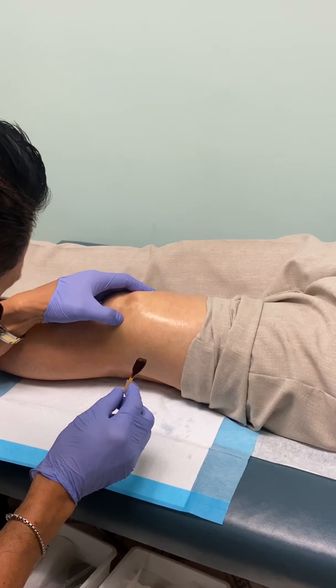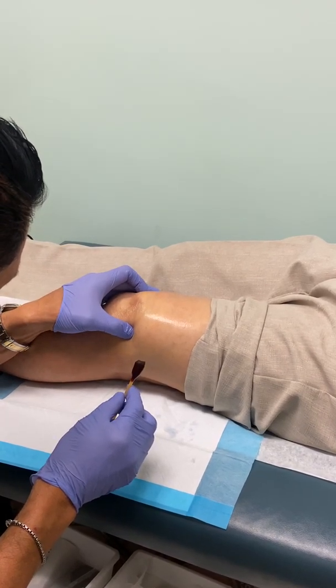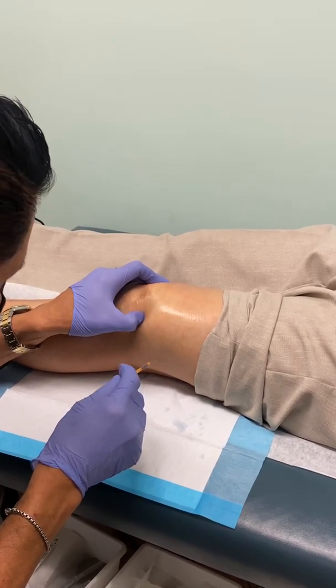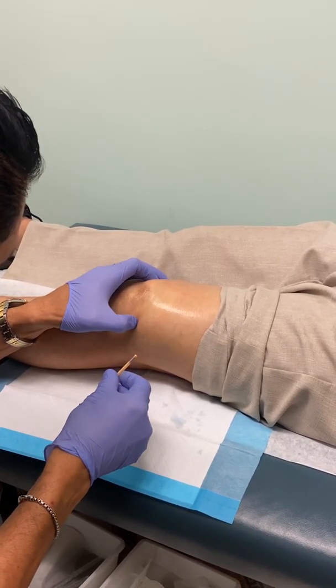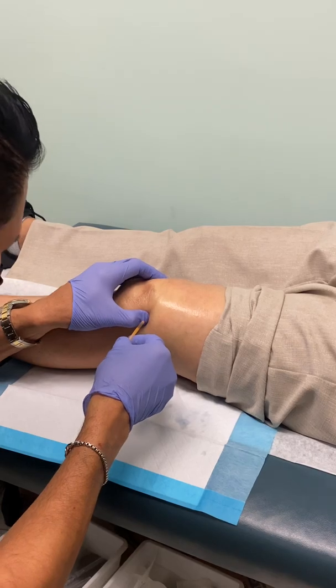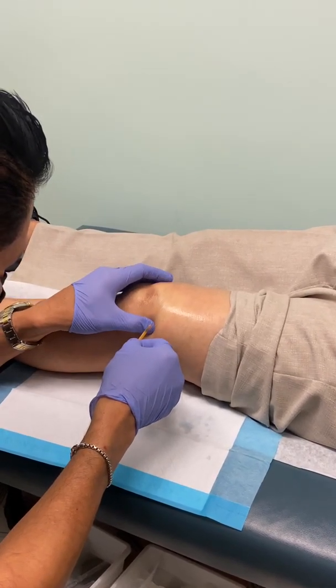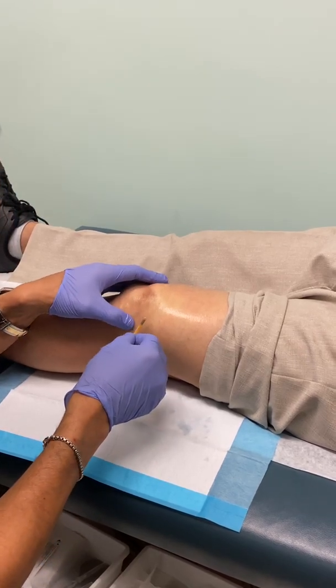So we're doing an aspiration of the knee here. This particular patient had an attempt by another physician, and I guess it wasn't successful. Now sometimes they're tricky, especially when there's a lot of arthritis.